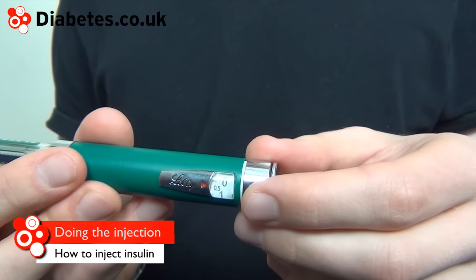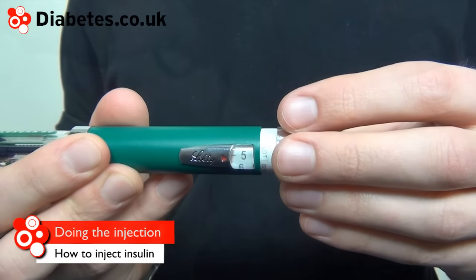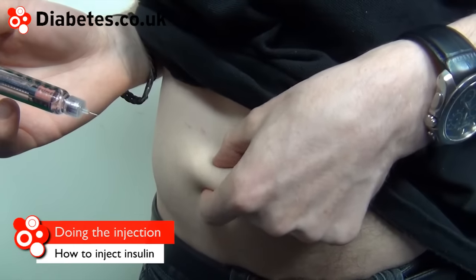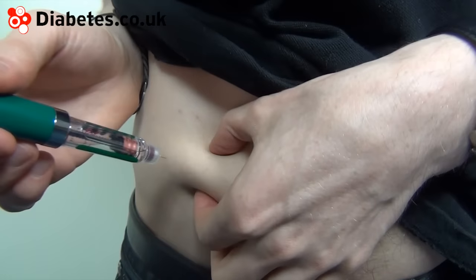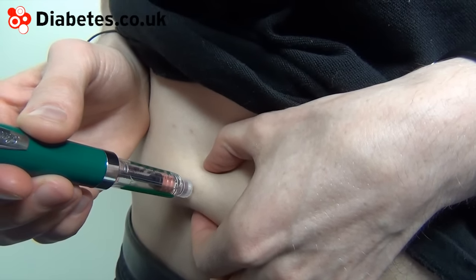Dial the dose needed. Here I'm going to put in five units of insulin. Take a fold of flesh — try to find a region that isn't tough or lumpy — and put the needle in.